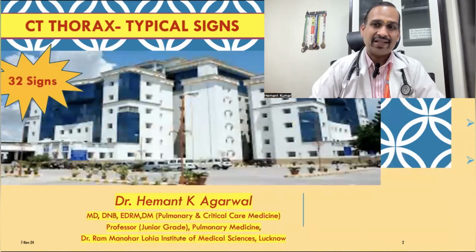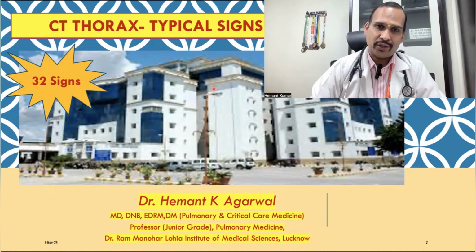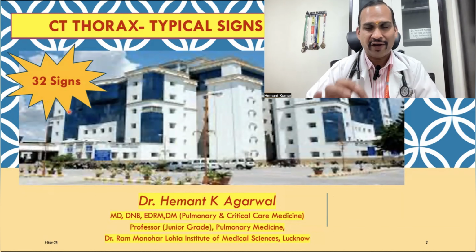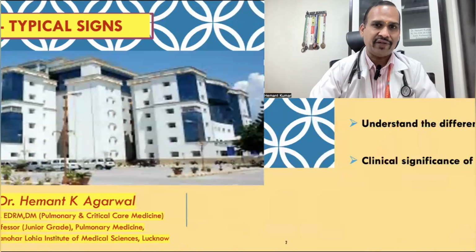Hello friends, after chest x-ray, today we are going to discuss CT scan thorax. In this module, we will discuss typical signs in CT scan thorax. We will discuss 32 named signs which are very important for your viva questions, NEET super specialty exam and of course NEET PG exam. So let's see one by one.